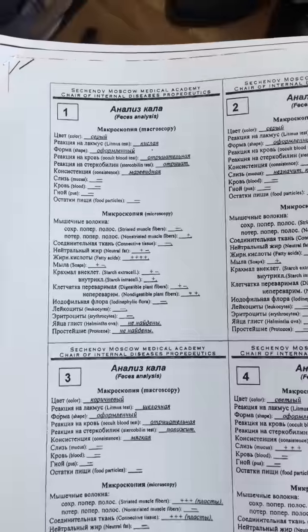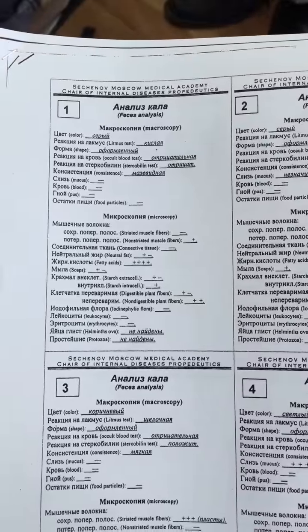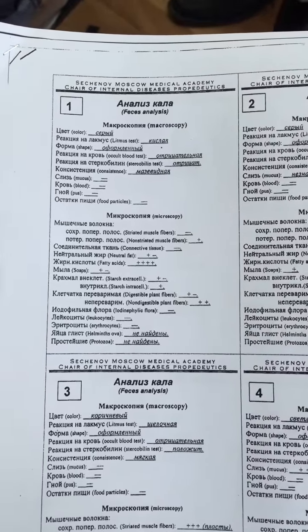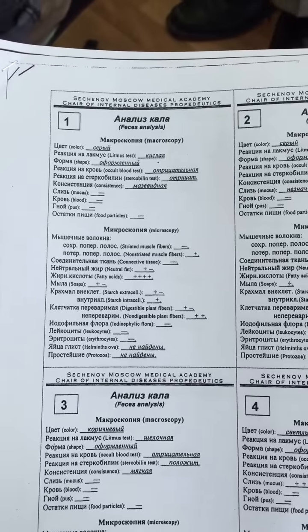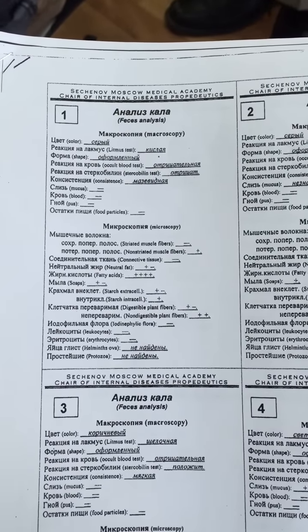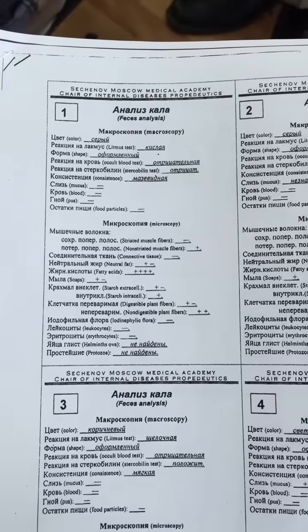Seri. Seri, it means gray. Litmus test. Reaction, yes? Acid. Sour. Shape is normal, formed.